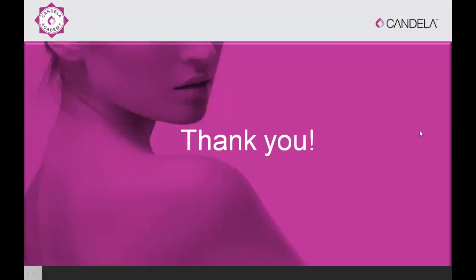Some of the questions are repetition. Does it matter if you would use zoom first, followed by resolve? No, I don't think so. There are colleagues who would use the zoom handpiece first, followed by the resolve handpiece. I like to start with the resolve handpiece and then do the zoom, and that's what we did when we were going to publish our series, and with many of the cases that I have shown you, that's how I have done it.